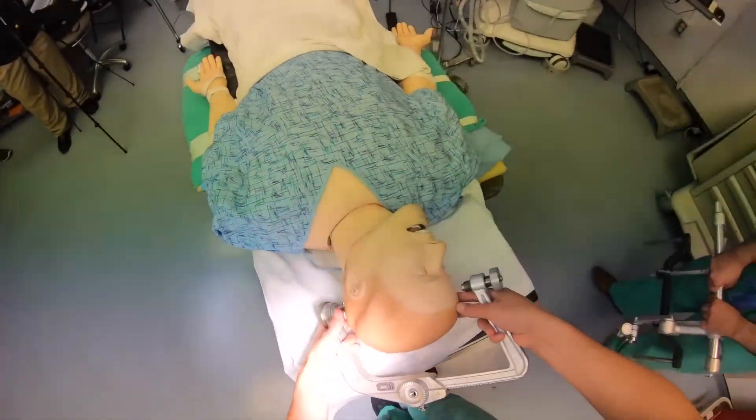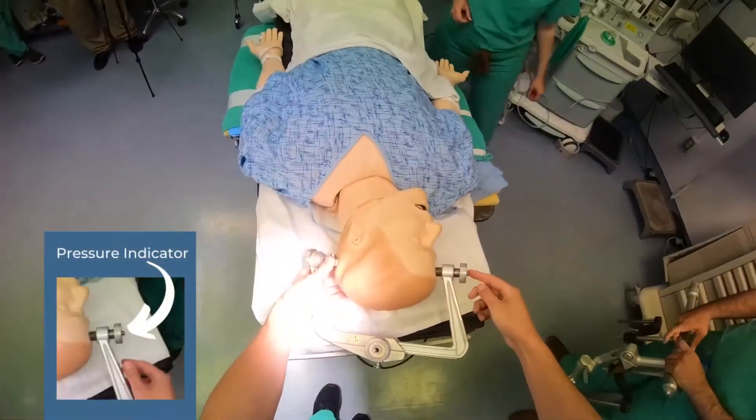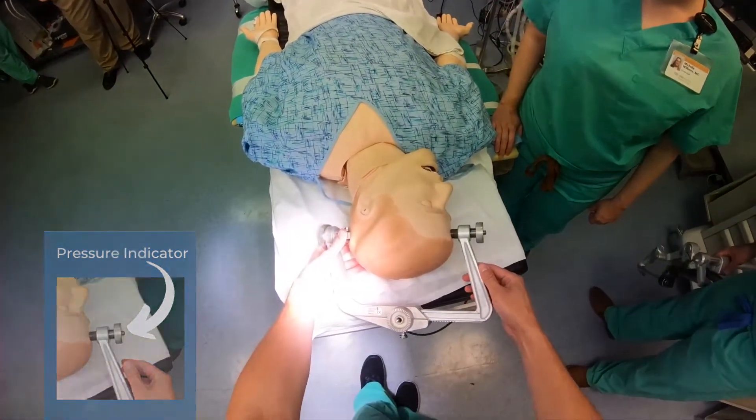Once everything is seated well, bring everything together. You'll notice the pressure gauge here — turn this until it shows three lines, or a pressure of 60 pounds.